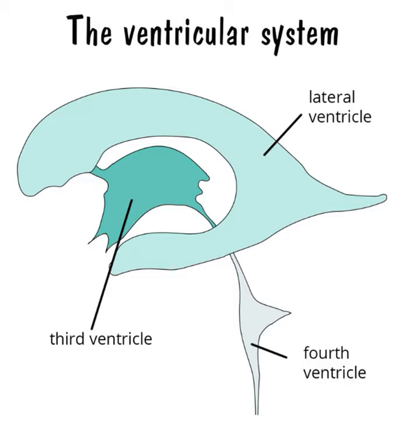One of the problems in imaging that you would commonly encounter is shunt dysfunction. If a shunt is in place, what are the imaging findings that could suggest shunt dysfunction? One, obviously, is the recurrence of hydrocephalus in a shunted patient. Second, fluid tracking along the shunt tubing. Any inflammation or fibrosis at the ends of the tubing can result in calcification.